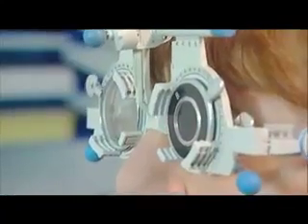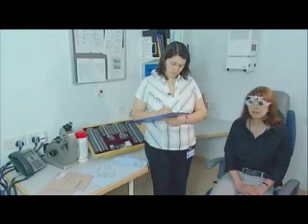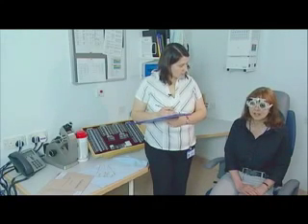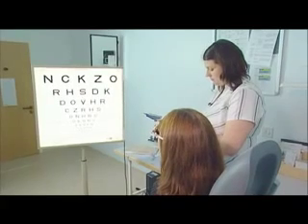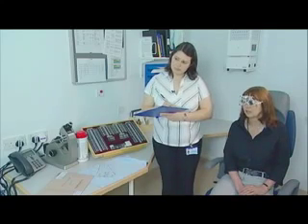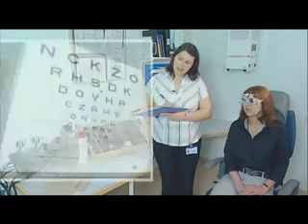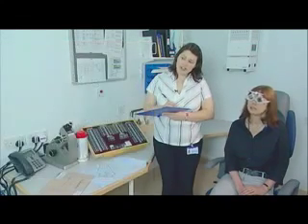The clinician monitors the head position to ensure that the distance is maintained at four metres, and ensures that accidental viewing by the fellow eye is avoided. The clinician is not allowed to point to letters or rows on the chart, but may guide the patient to a lost line by referring to guide marks on the chart, such as the double bars running across the chart.